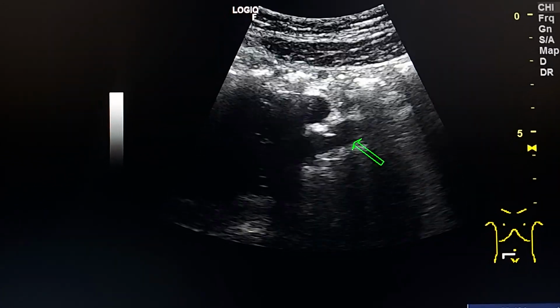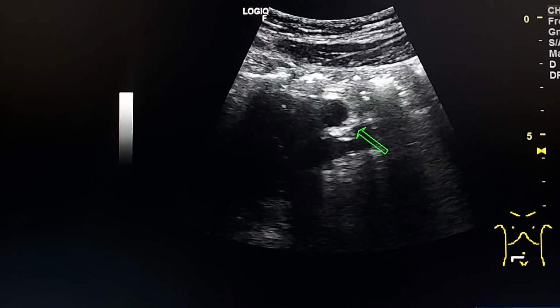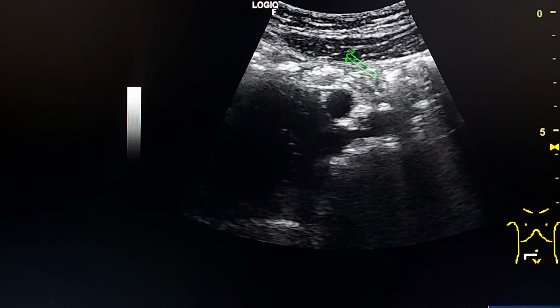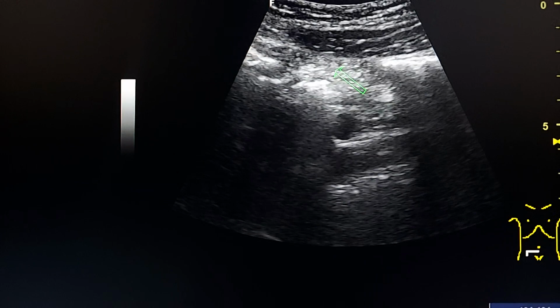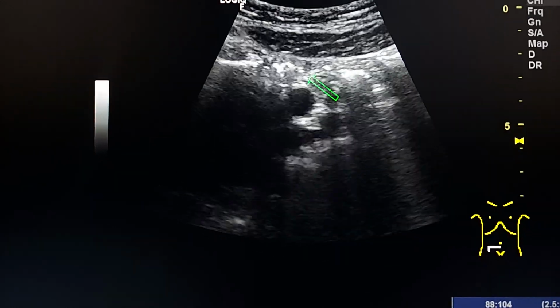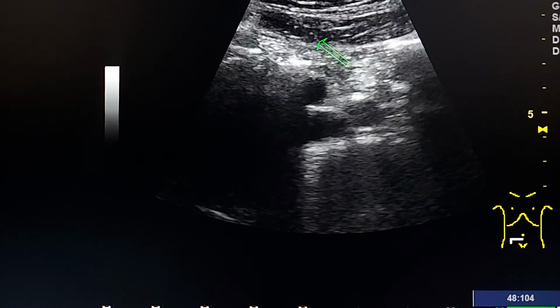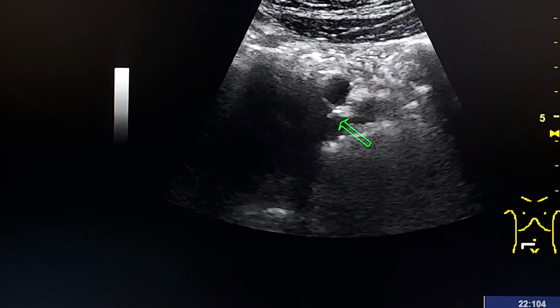Of course, the iliac vessels most of the time are not seen directly by the ultrasound probe unless we slightly push in this area to make the small bowel loops slide away from between the anterior abdominal wall and the iliac vessels.